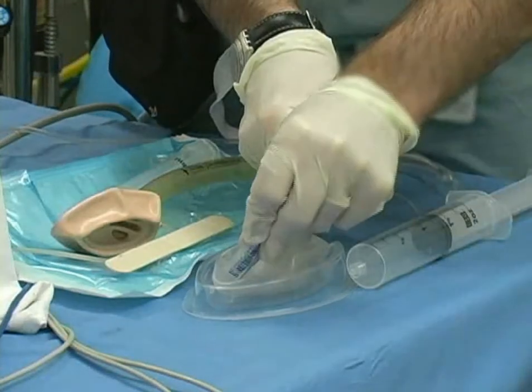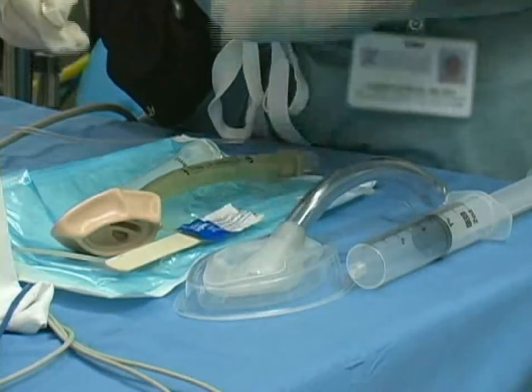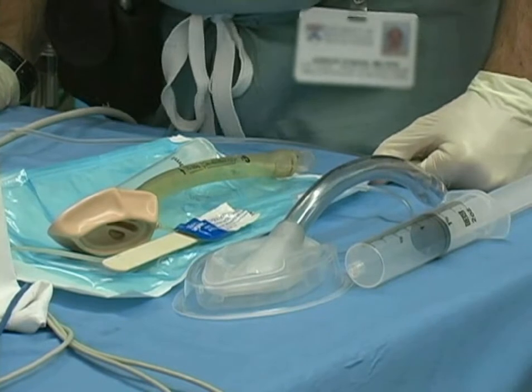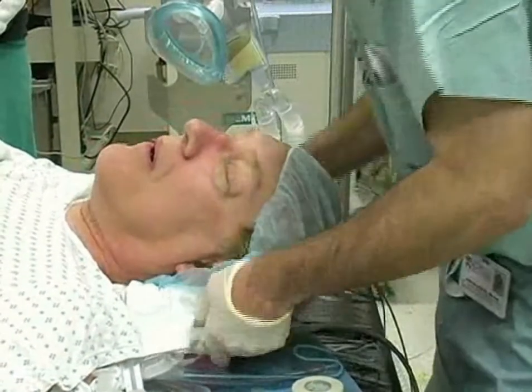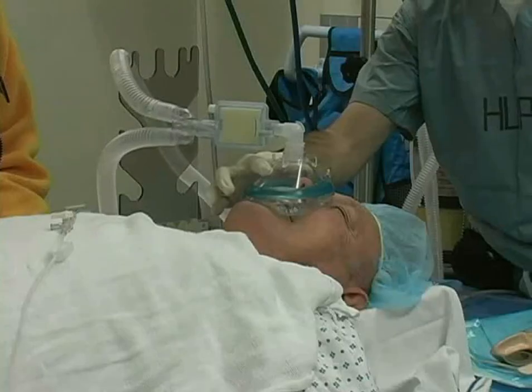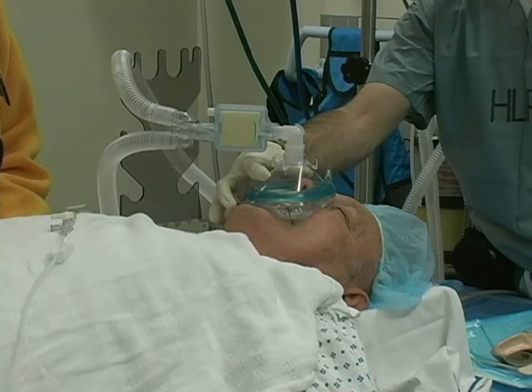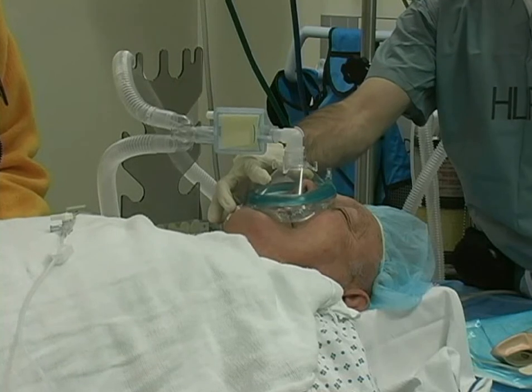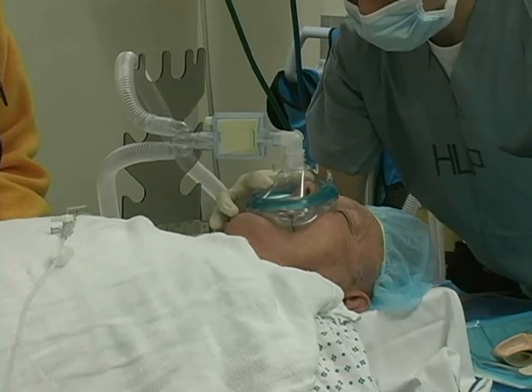Lightly lubricate the posterior surface of the cuff. Water-based lubricant is a safe and effective gel and its use is recommended for LMA insertion. With the patient in a supine position, tuck the foam pillow behind the base of the head to gently extend the neck. Induction of anesthesia is initiated while the patient breathes 100% oxygen. After ensuring the patient can be successfully ventilated using a mask, you may proceed with LMA insertion.